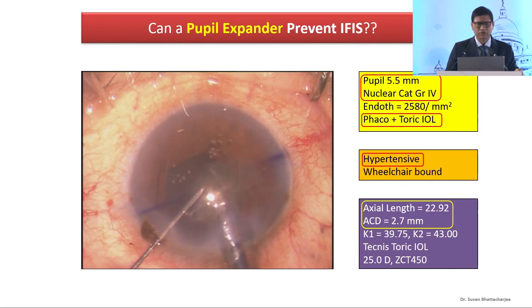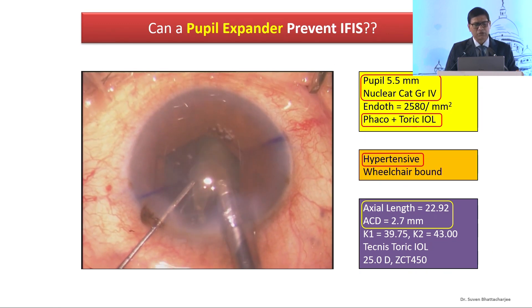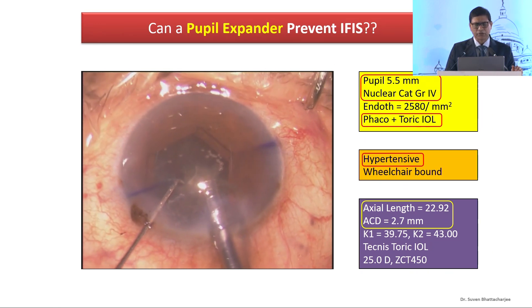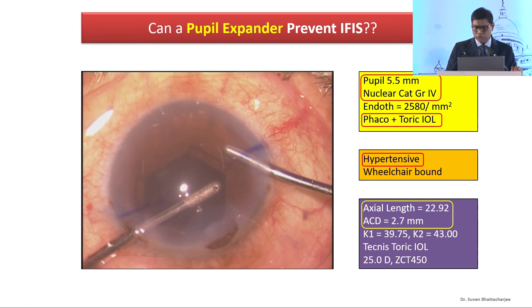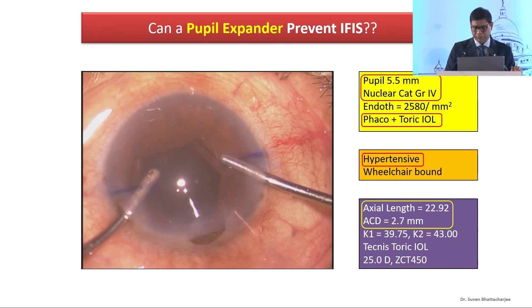Can pupil expanders prevent IFIS? Unfortunately, no. You can see my iris prolapsing through the side port, and very shortly you will see that it's prolapsing through the main incision as well. So no device technically prevents IFIS.